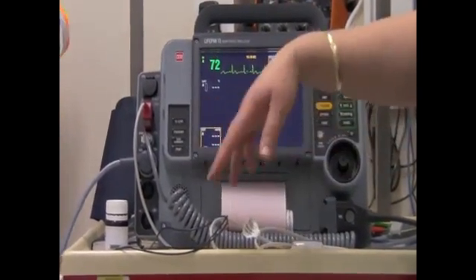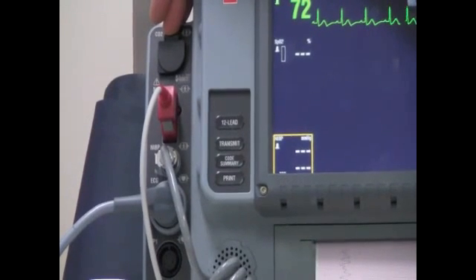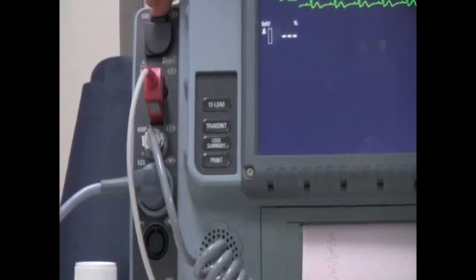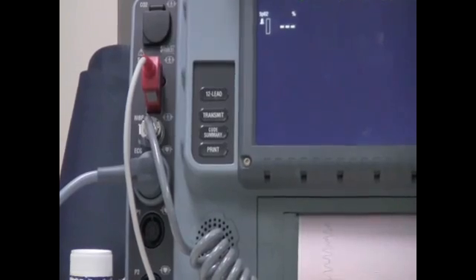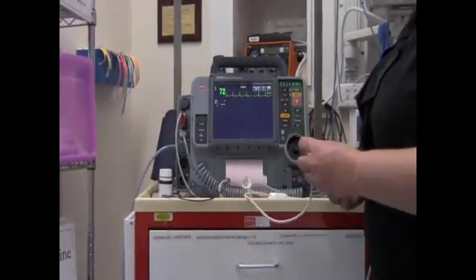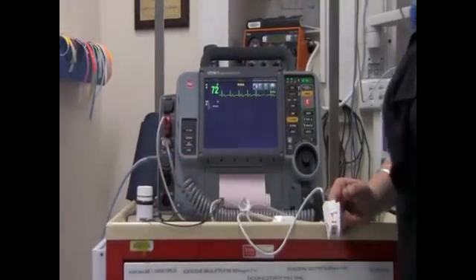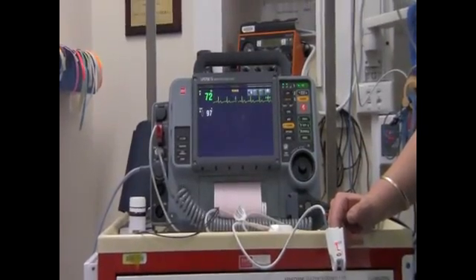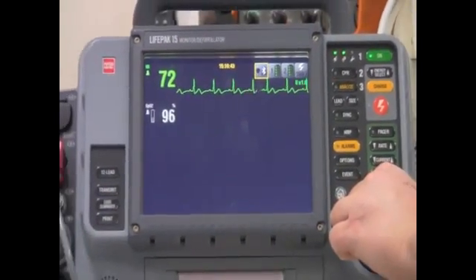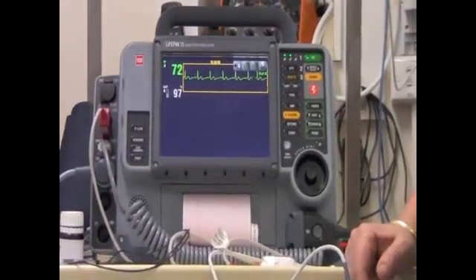On the other side of it, as I was saying before, we have end-tidal CO2 monitoring, and that's an inline monitoring. So basically for ventilated patients, you put it in between the ET tube and bring it back to the LIFEPAK, and it will deliver a value for end-tidal CO2 with a waveform. The SATS monitor is like any other SATS monitor, it goes onto the finger and it will deliver a trace, as well as giving a numeric value. And then there's pressure 1 and pressure 2, and that's for invasive blood pressure monitoring, so arterial line monitoring, and you get a waveform with that as well. The waveforms for each of those different measurements will show up lower than the cardiac tracing.